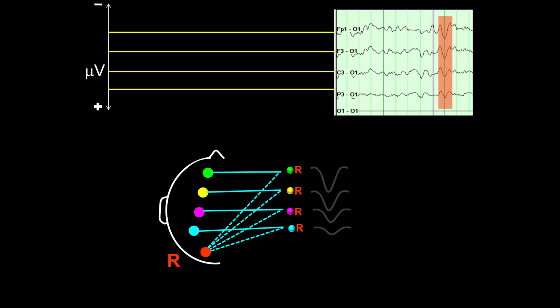Although I hate to remind you at this point because it makes our explanation a little bit more confusing, I nevertheless will remind you that we are basing that the reference electrode is either the minimum or the maximum on two assumptions. These assumptions are, as we previously mentioned, sound because most of the time they are correct based on experience.